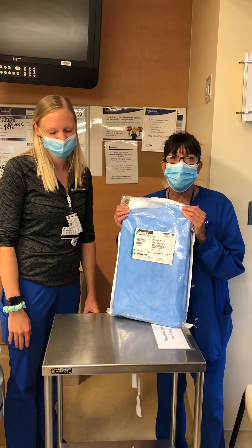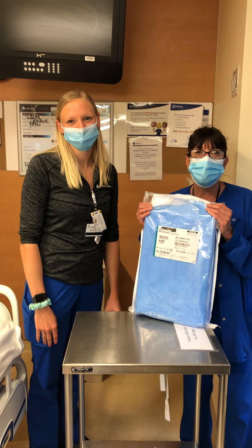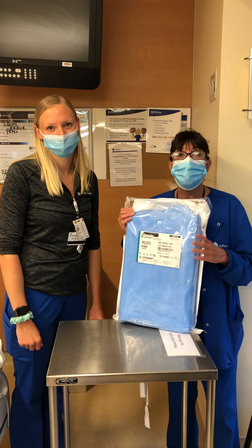Hi, Jess and I are here. I'm Debbie Gardner from the Cleanse Pack from 7 Center. We're here to show you how to set up a chest tube.